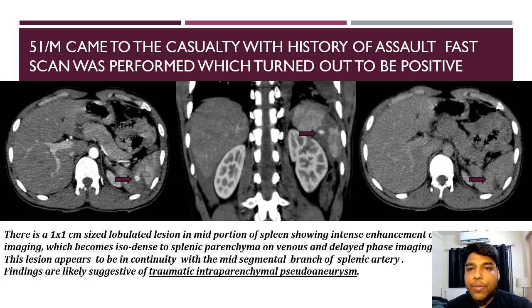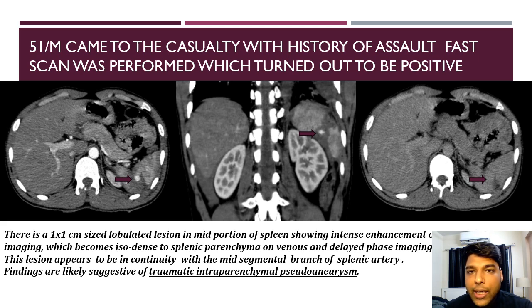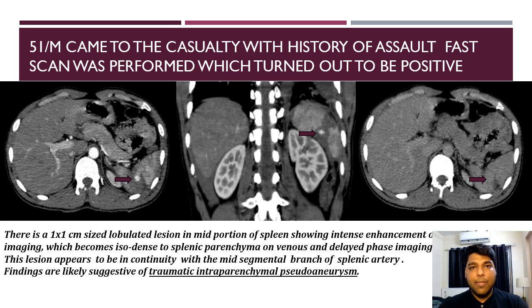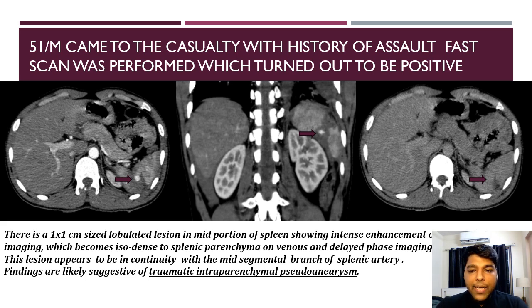Case 4: A 51-year-old male came to casualty with history of assault. FAST scan was performed which turned out to be positive. There is a 1x1 cm sized lobulated lesion in the mid portion of the spleen, showing intense enhancement on arterial phase imaging, which becomes isodense to splenic parenchyma on venous and delayed phase imaging. This lesion appears to be in continuity with the mid segmental branch of the splenic artery, findings likely suggestive of traumatic intra-parenchymal pseudoaneurysm.